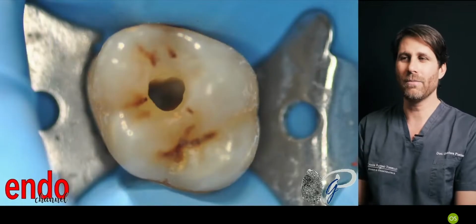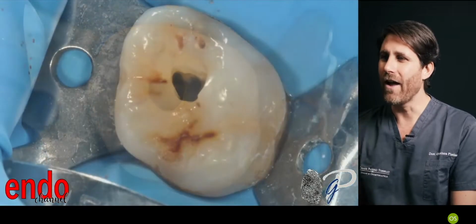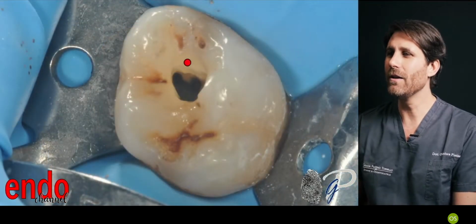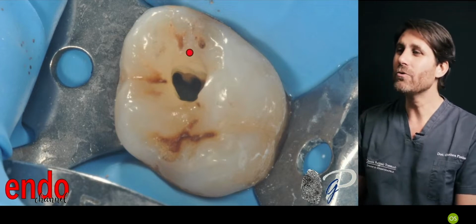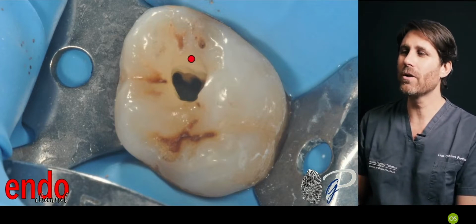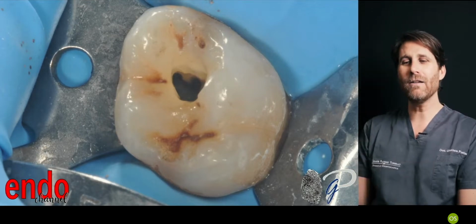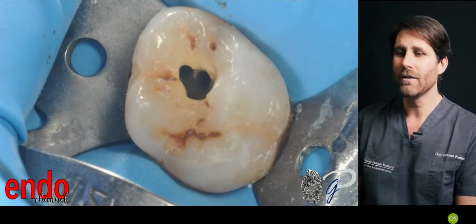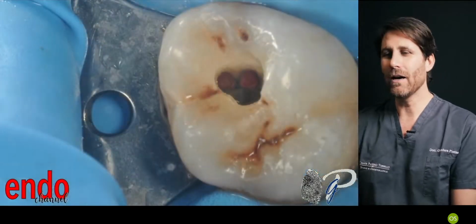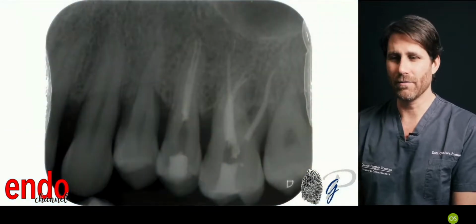Again, this concept in a clinical case: an occlusal beveled surface, you can see the bevel here, how to remove the enamel, but you can clearly see the two mesiobuccal roots, MB1 and MB2, easily, effectively and clearly treated through this access cavity, this conservative access cavity. These are enlarged and these are filled. And this is the final radiograph of this concept.